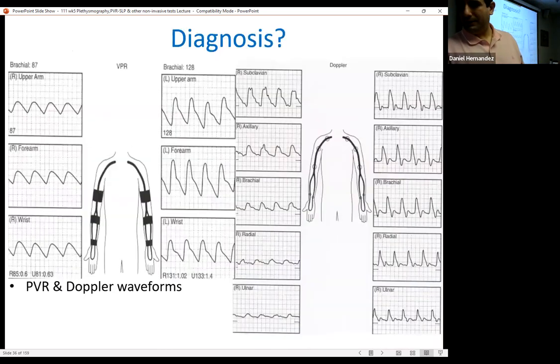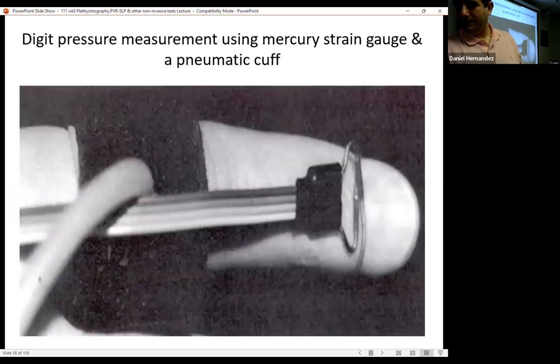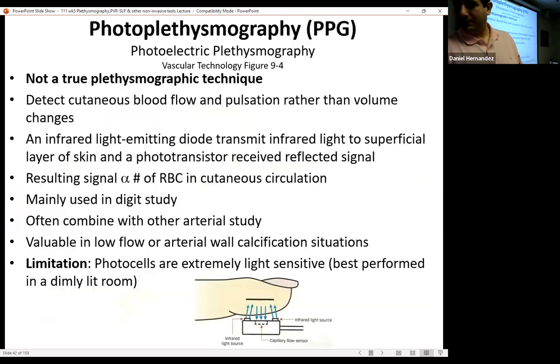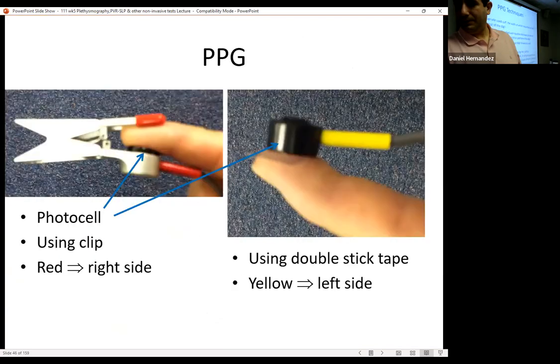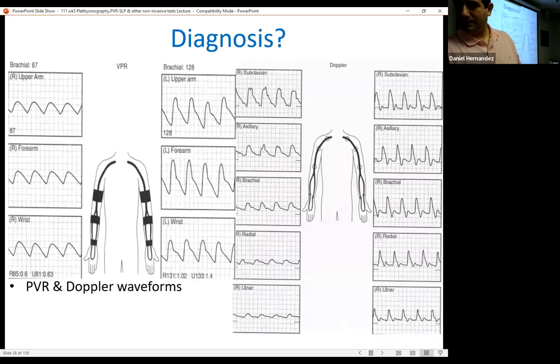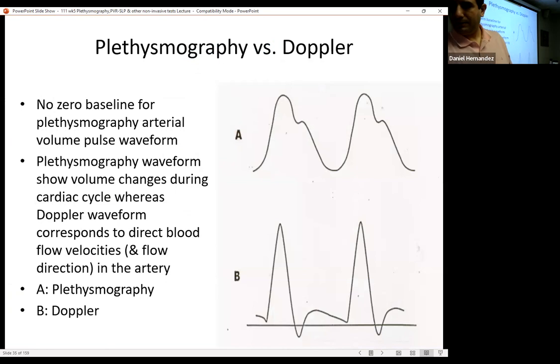Let me see, because I was going to say the other graph has a red line. So the tracings I'll give you on the test, you'll see this obvious baseline coming across. So if you see a baseline, basically you'll know it's a Doppler. Or plethysmography.